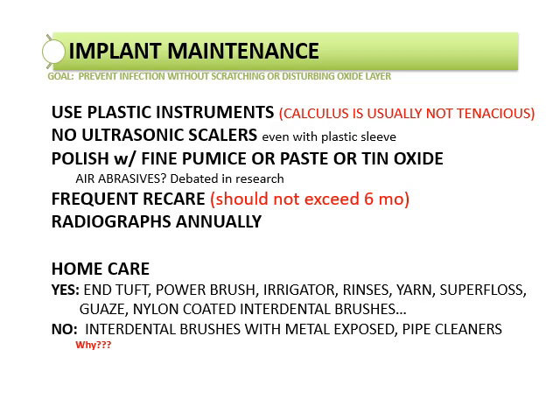The book implies that we can polish with fine pumice or paste or tin oxide. I do have tin oxide in the clinic if you guys wanted to use that. It's just softer. Jewelers use tin oxide to polish jewelry with. Your implant maintenance patients should be on no more than a 6-month recare, just like regular standard natural teeth. You should take a radiograph of an implant to see if there's bone integration or to see if there is widening of bone. Again, it could lead to implant failure.